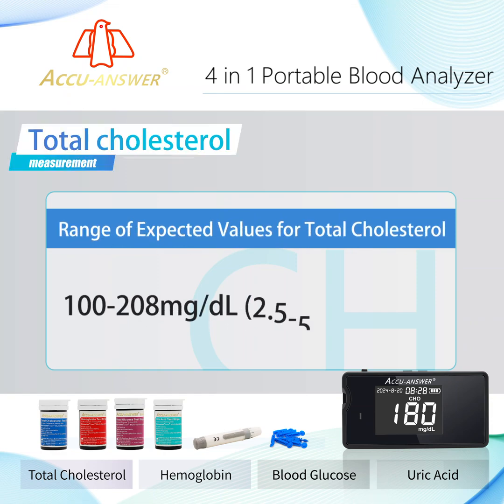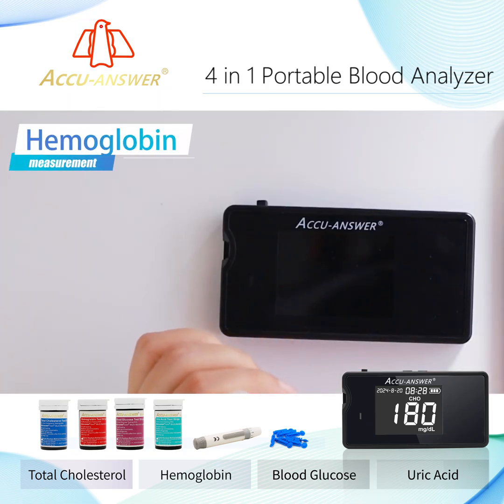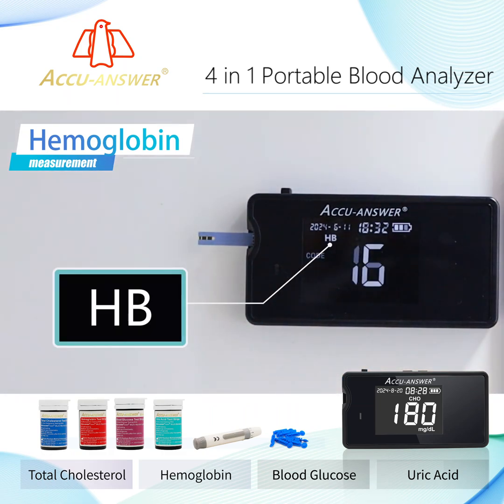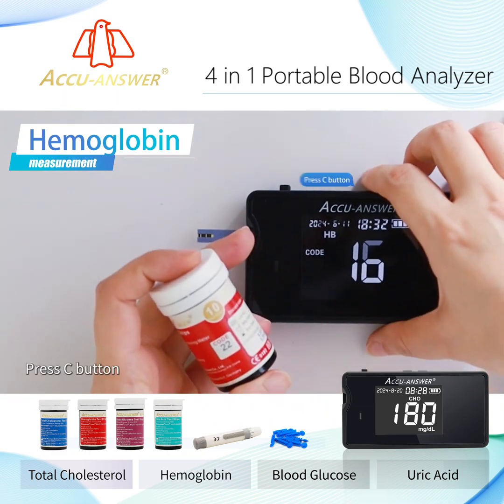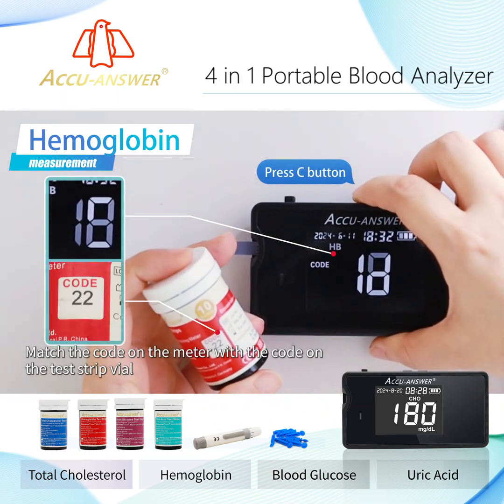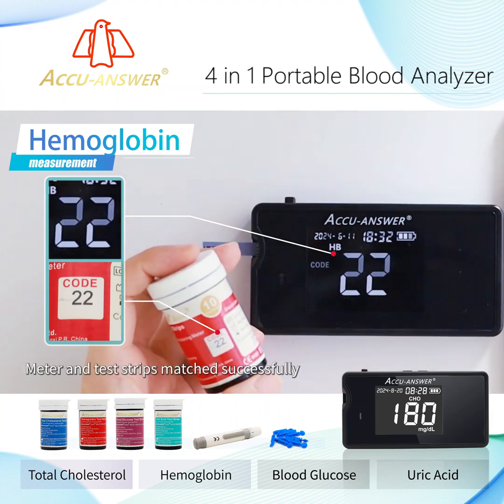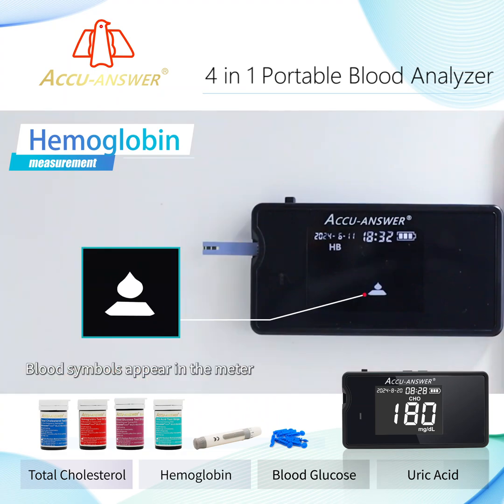Range of expected values for total cholesterol. Insert the test strip to turn on the meter. Press the C button and match the code on the meter with the code on the test strip vial. Meter and test strips matched successfully — blood symbols appear on the meter.